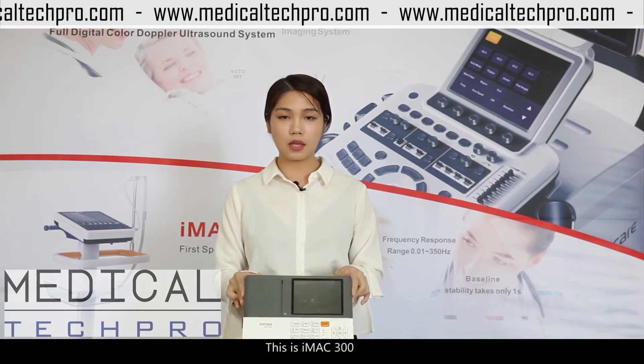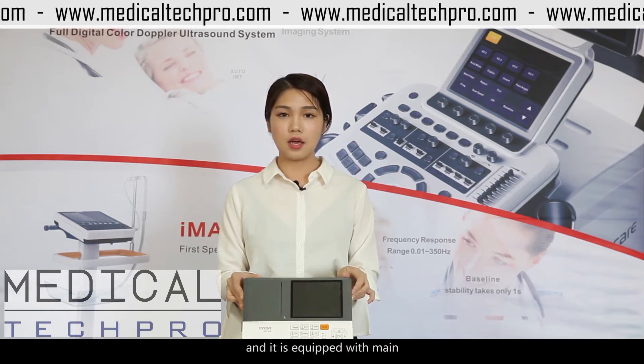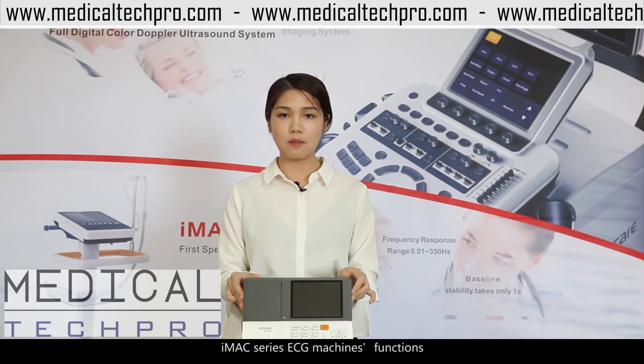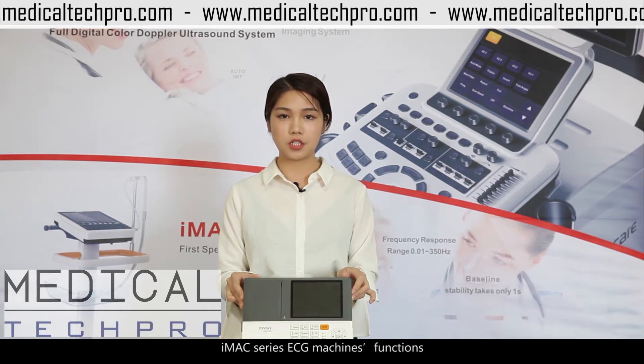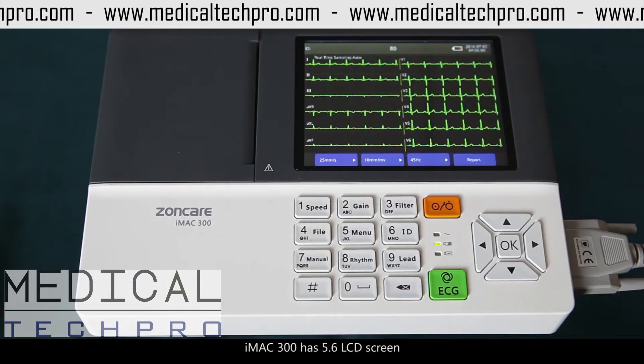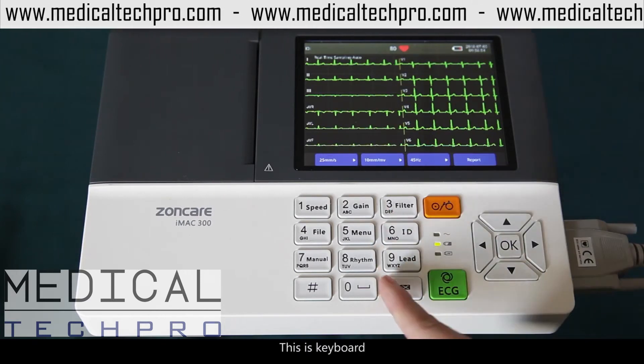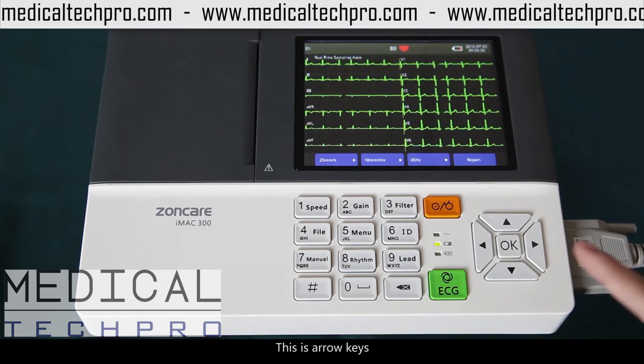This is the iMac 300. It's very light and convenient, and it's equipped with the main iMac series ECG machine functions. The iMac 300 has a 5.6-inch LCD screen. This is the keyboard, and this is the arrow keys.